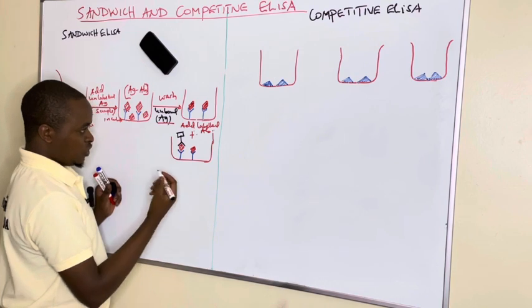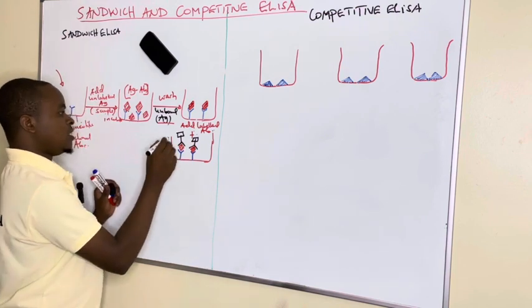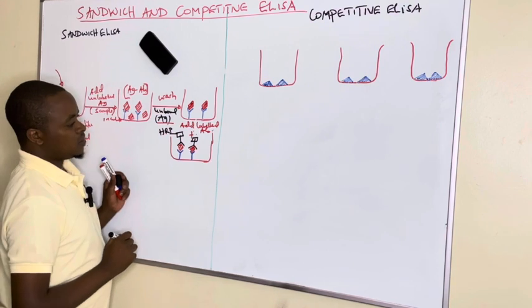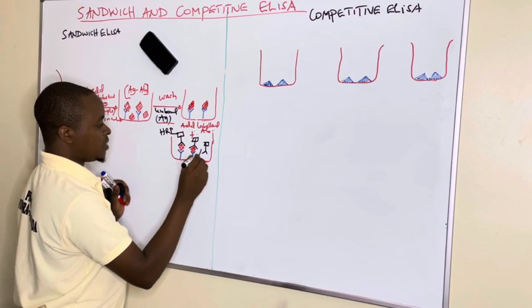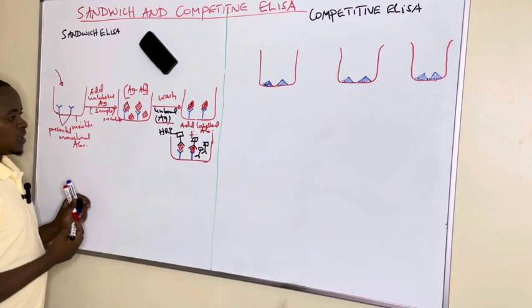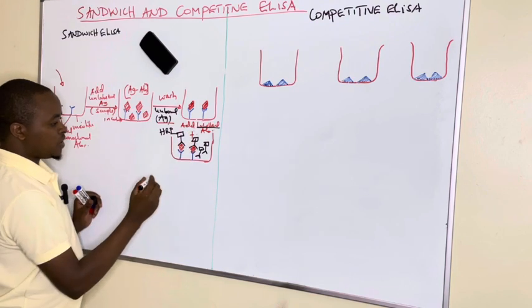We add and incubate, and they come and bind. The common enzyme used is horseradish peroxidase. They are in excess, so some will lack where to bind, and we find some excess not binding. During incubation, after adding this labeled antibody, it binds, or it sandwiches.